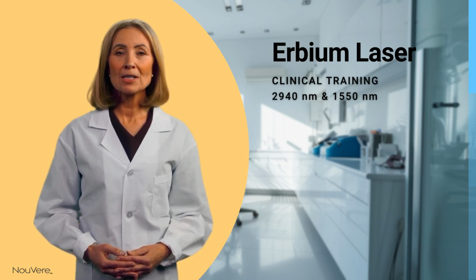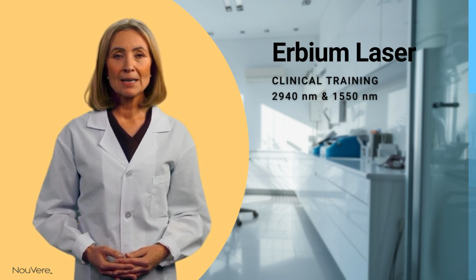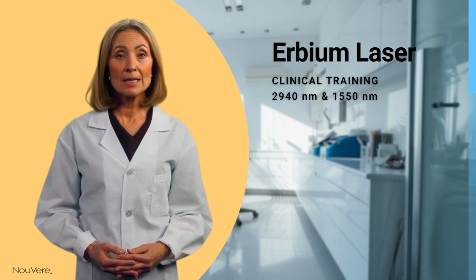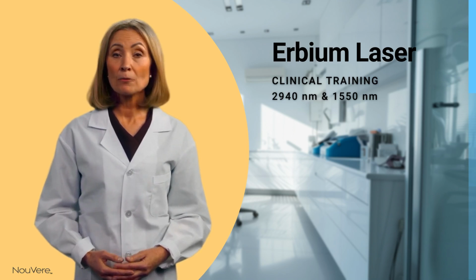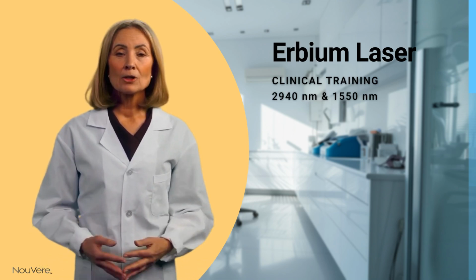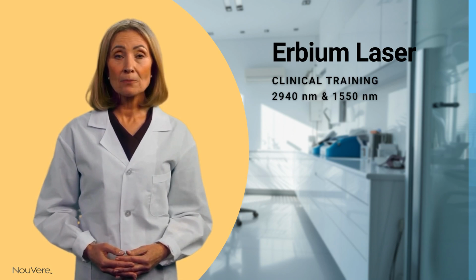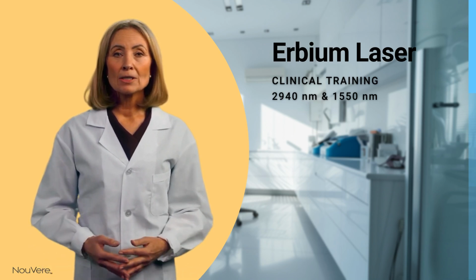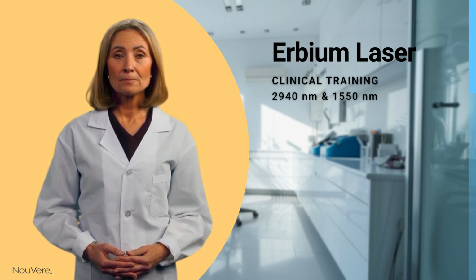As this type of laser can cause potential injury to patients, it is important to exercise restraint and caution when setting the parameters. In addition, performing a spot test prior will allow you to treat better and help manage the comfort of your patients. Before watching this video, make sure that you have received your laser safety training as a prerequisite to watching this video.